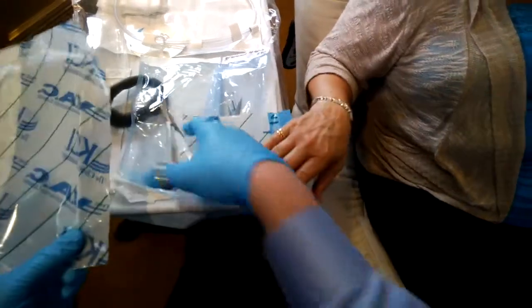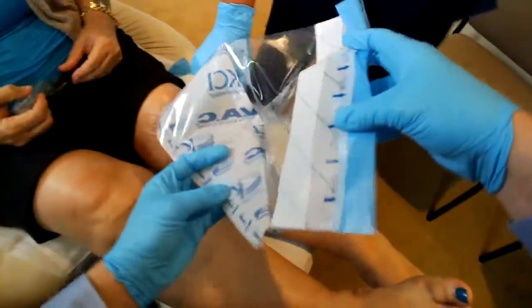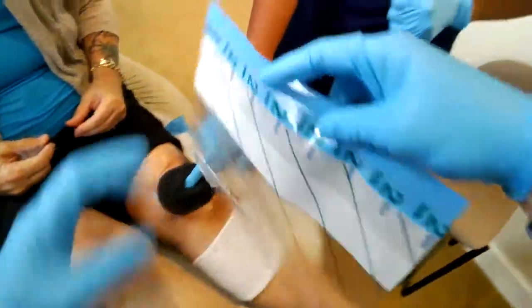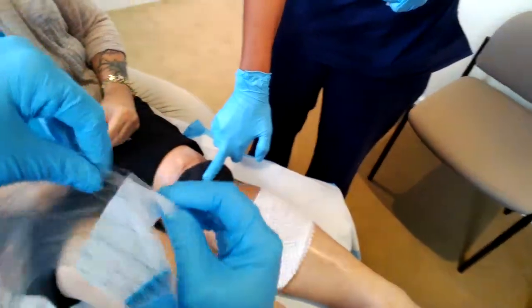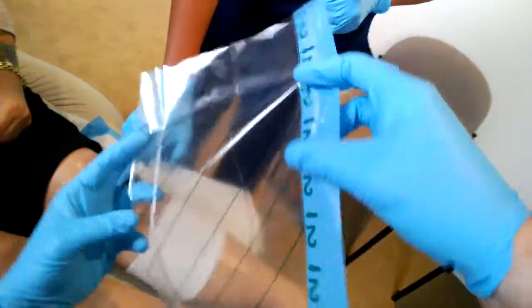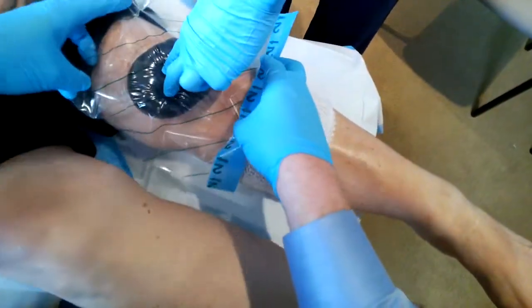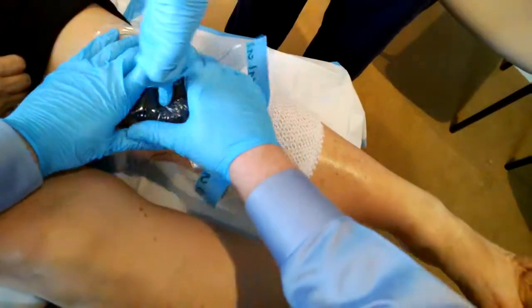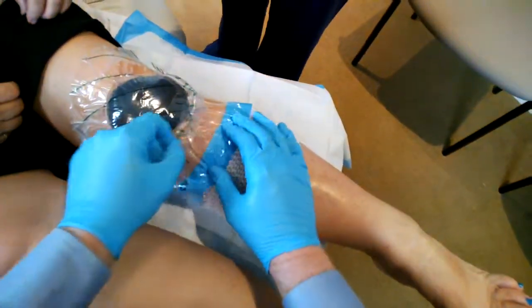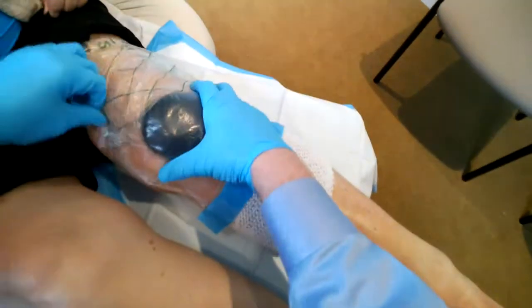More arts and crafts here. I'm going to apply this right onto our sponge, and the goal is to get a seal all the way around. It's kind of like a Christmas package — shrink wrapped. We remove the outer seal, and now I have the sponge directly on the wound.